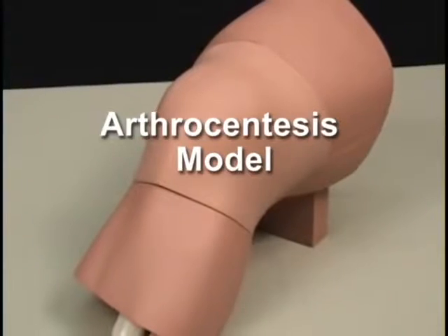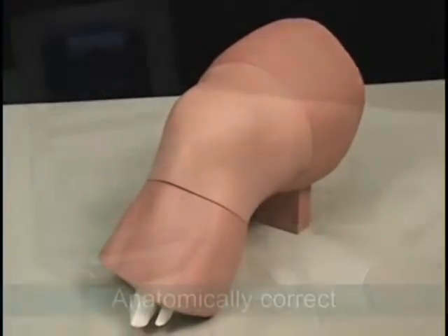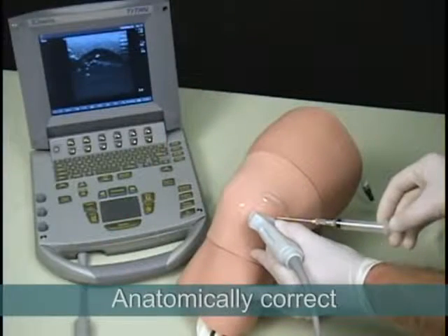Simulab's arthrocentesis model is a realistic soft tissue trainer that includes all anatomy significant to the procedure.